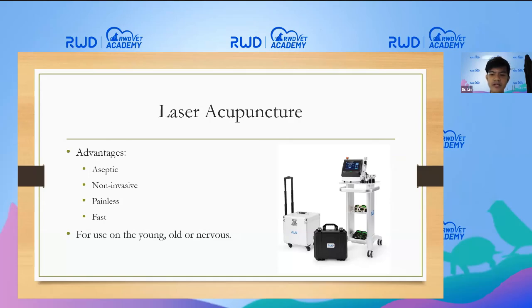The non-invasive nature of laser also minimizes the risk of adverse events, such as organ puncture, infection, or bleeding complications. Laser also facilitates stimulation of areas that are difficult or uncomfortable to needle, such as auricular acupoints. By using a multi-channel laser system, multiple acupoints can be treated simultaneously, just as in a metal needle acupuncture treatment.